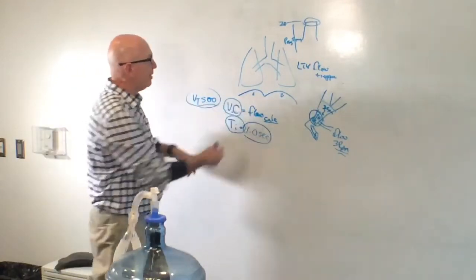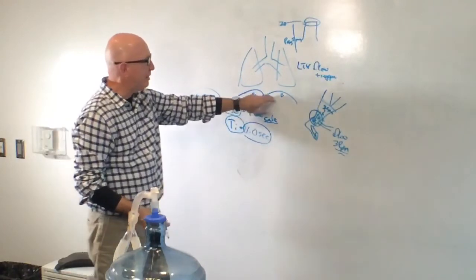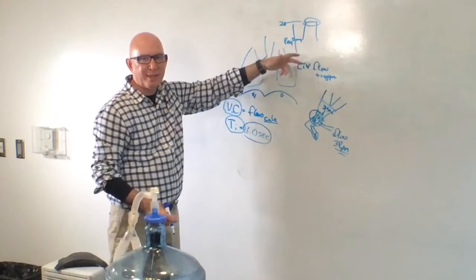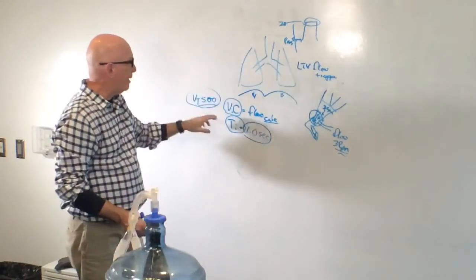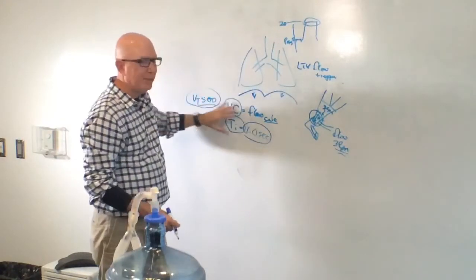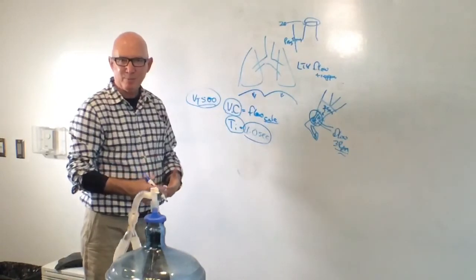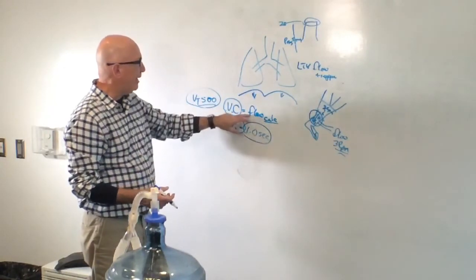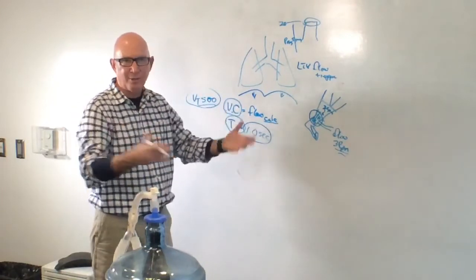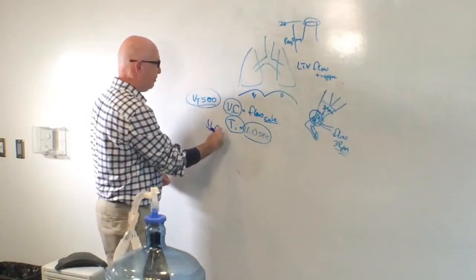But we started out by talking about the trigger for ventilation, and this is part of where the dyssynchrony actually occurs, is the patient starts to inhale and there's a bit of time before the ventilator catches up. Now, the flow in volume control during the inspiratory phase, the machine can't do anything about that. So even if the patient sucks more on the ventilator to get more flow, the ventilator can't change that flow when you're in volume control. It simply says, I'm delivering this volume, and that's the flow rate that you're going to get with it. What happens is that you'll just have a lower PIP.